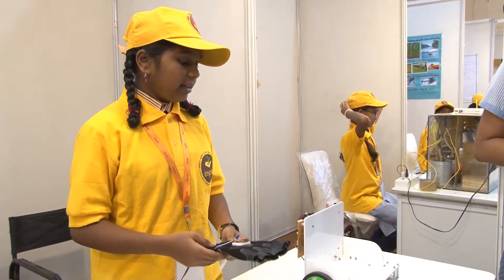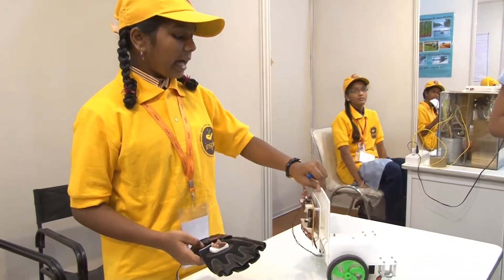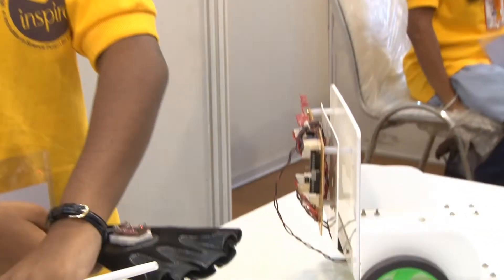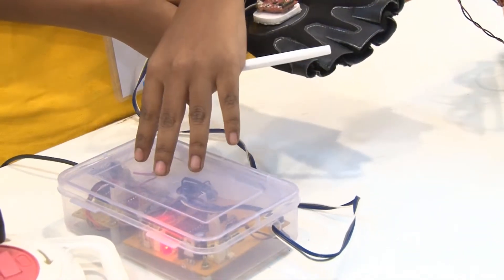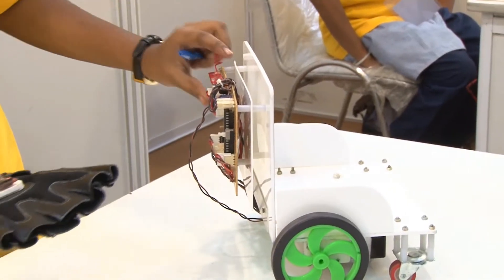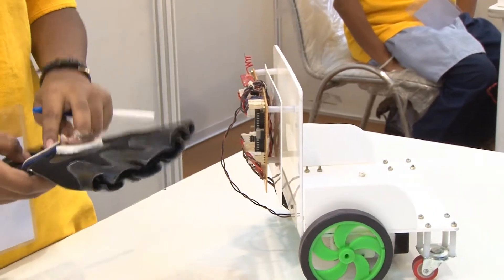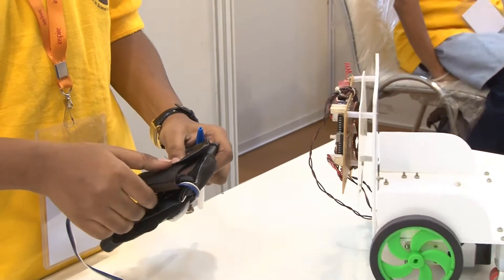In this wheelchair we have a receiver section and a transmitter section. This is called the RF receiver and this is called the transmitter section. The transmitter section sends radio frequencies, which the RF receiver picks up, and according to our instructions given from this sensor, it can move.